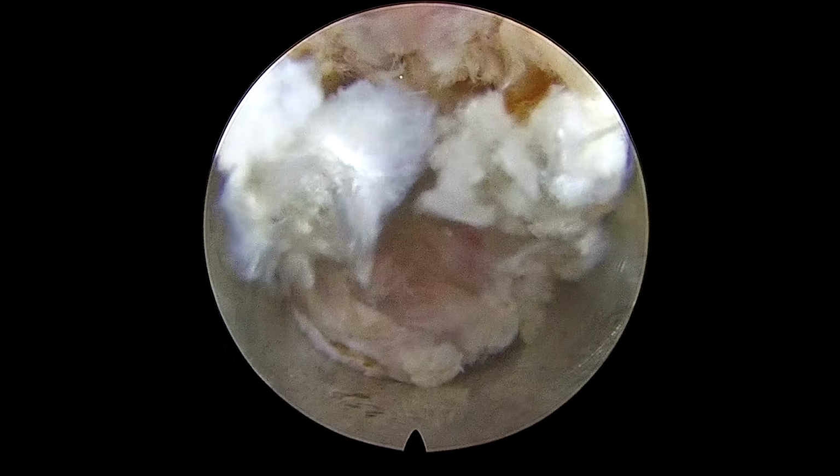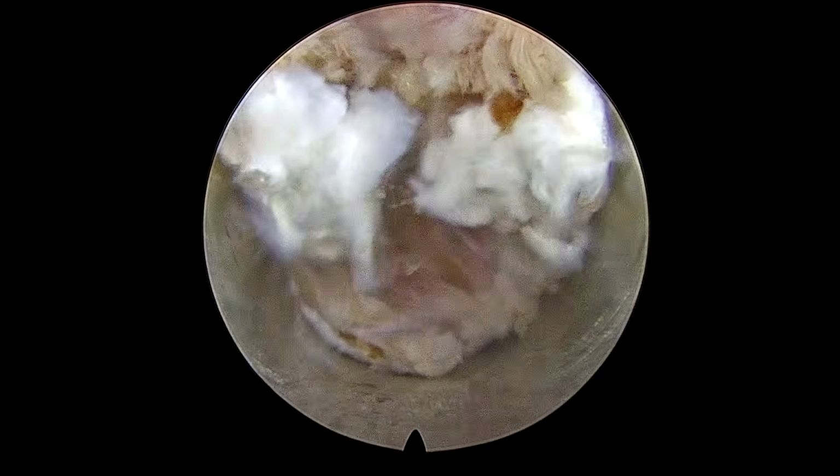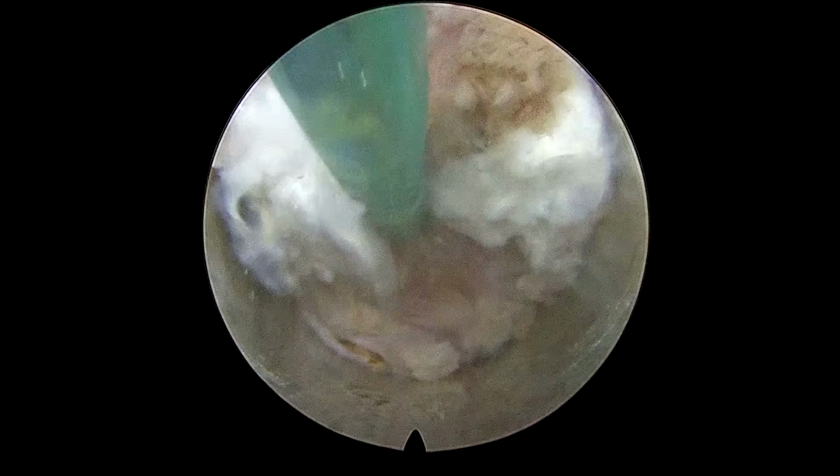Once you have coagulated all the vessels, now you can start removing the soft tissues from the interlaminar space here.